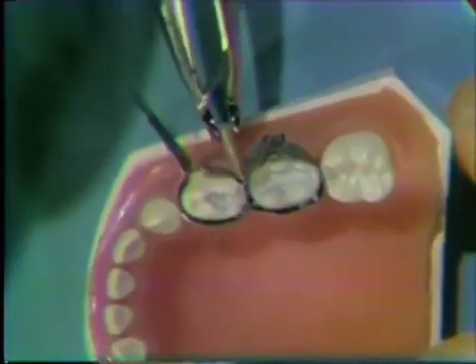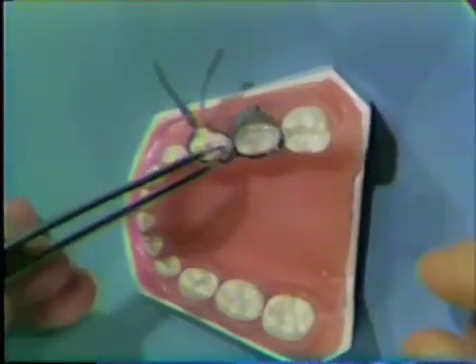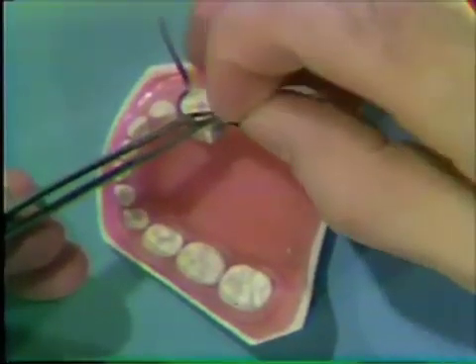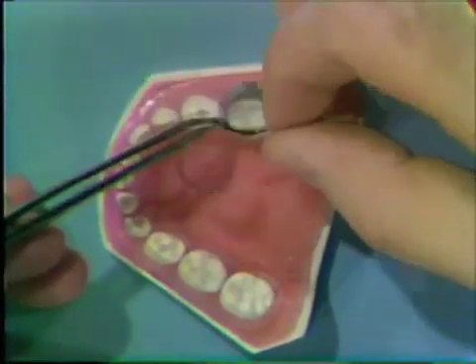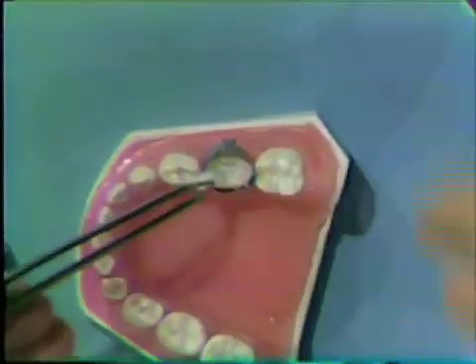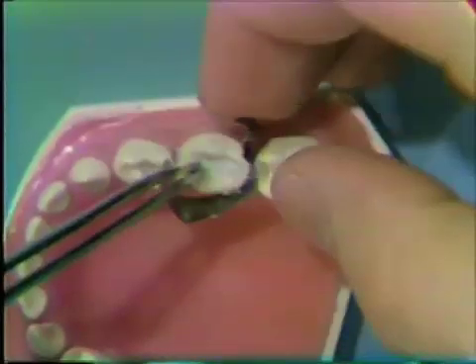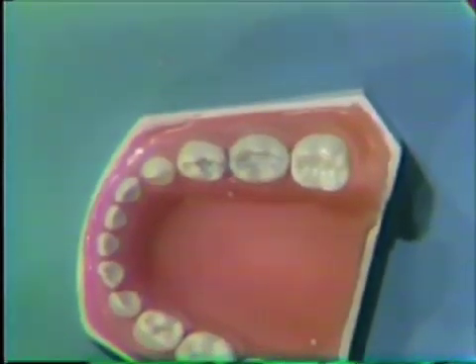Both parts of the band are apart now and are ready to remove the matrix band. We'll remove the wedge with the same instrument used to place it — the Howe pliers. Then, using a moistened cotton pellet and college pliers, stabilize the marginal ridge and remove the band segments. The most occlusal one is removed first — in this case the Tofflemire band — and then the spot welded band will be removed. And we are ready to proceed with the final part of our carving procedure.